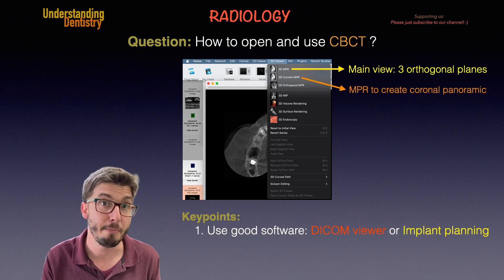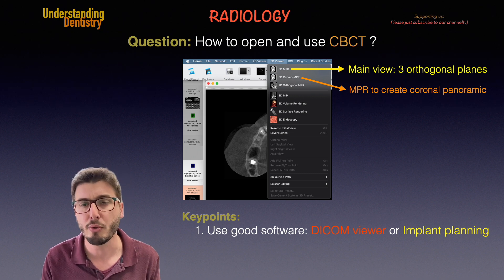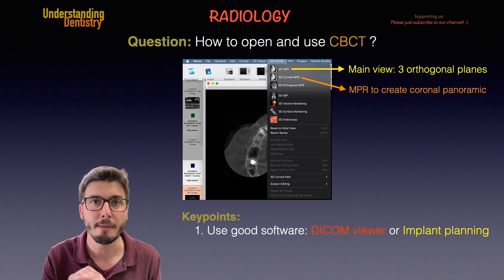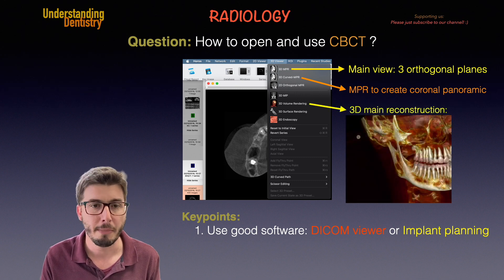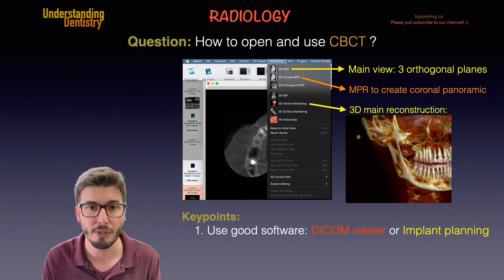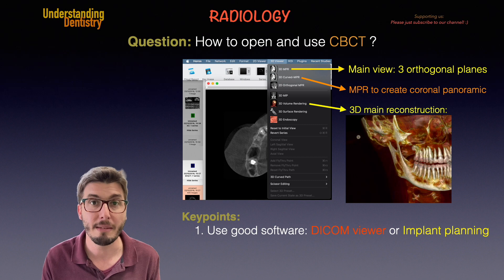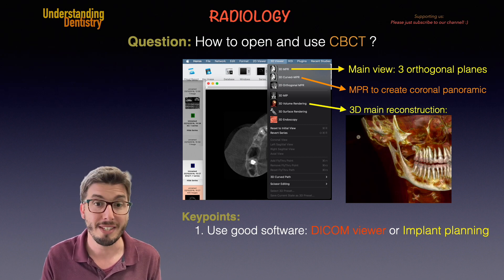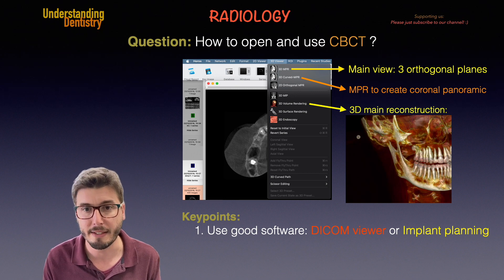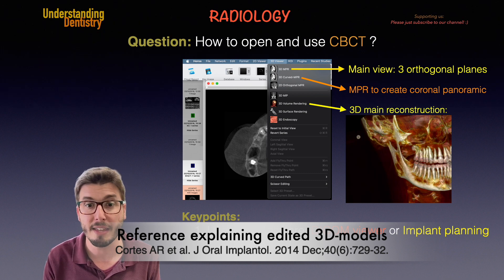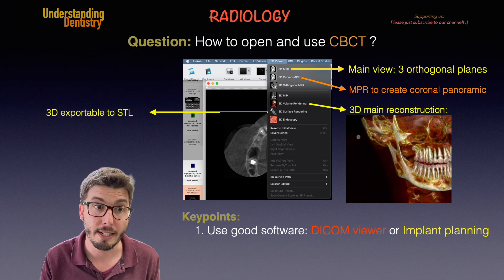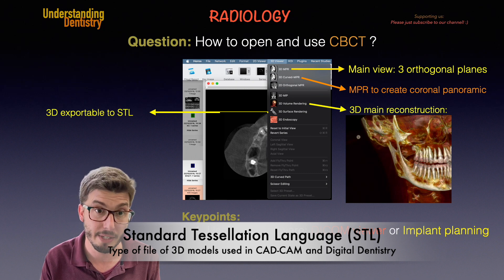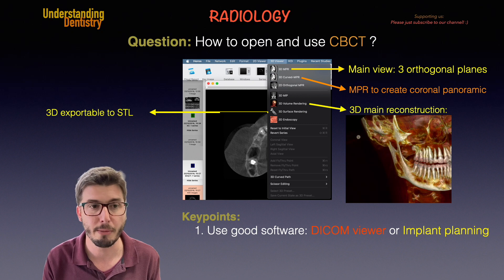Then we have the curved MPR — the curved multiplanar reconstruction — which is used to create the coronal panoramic view by putting points on the axial slice to shape the panoramic view we want to make. The main option for 3D volume rendering allows us to obtain very nice 3D CBCT reconstructed models. The image you are seeing is a 3D reconstructed model edited with threshold colored edition, which is why you can see the teeth and the root inside the bone. Another option is the 3D surface rendering, which allows for exporting files to the STL format.